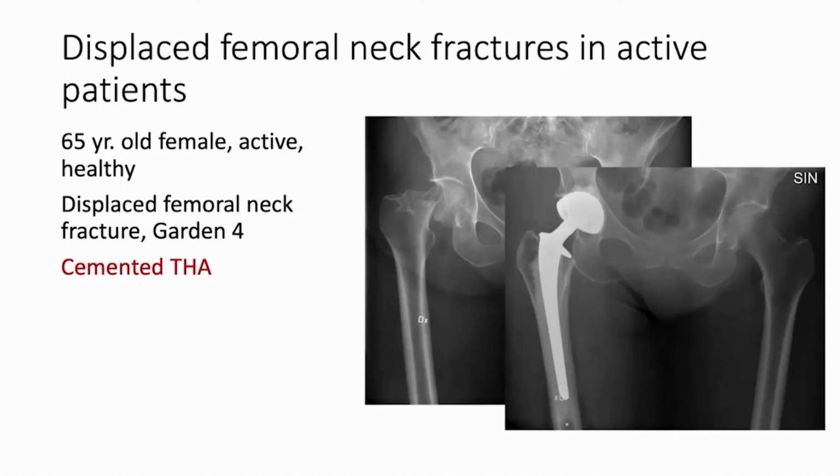And we would, in a fracture patient, also consider using a dual mobility cup. The evidence supporting the use of dual mobility cups is slightly weaker, and that's a point that we might want to discuss later on today.